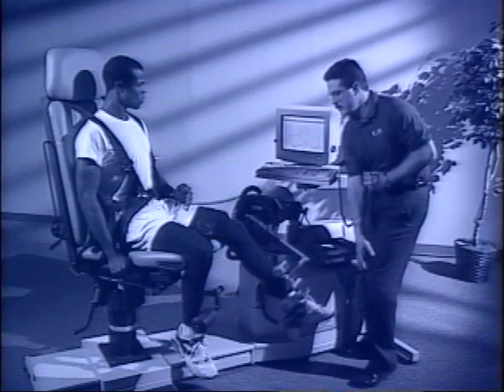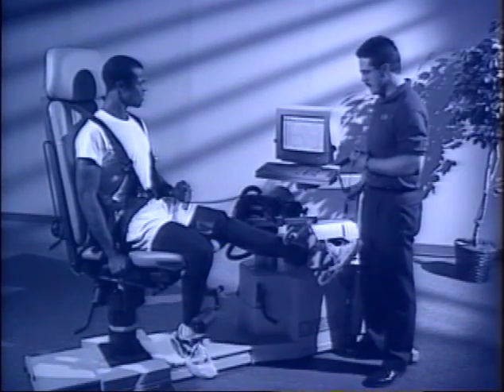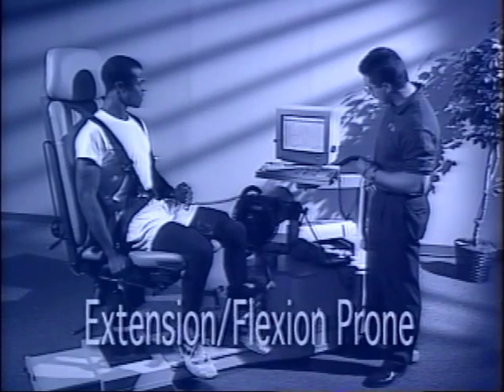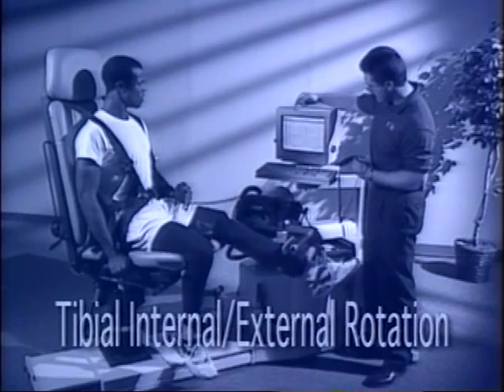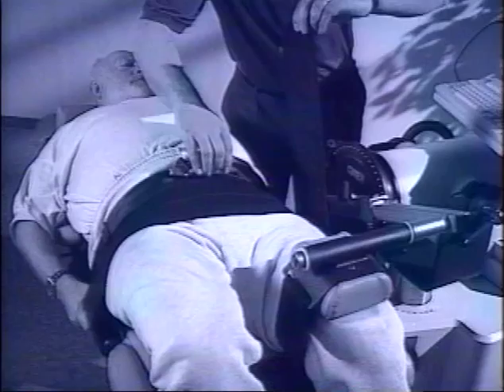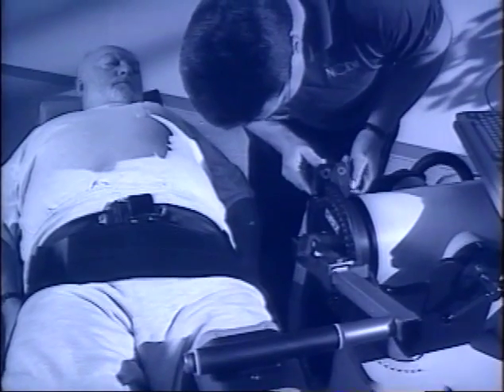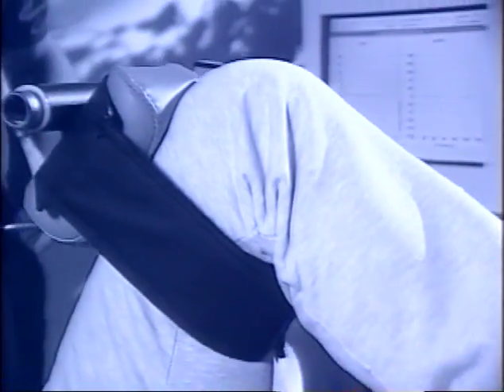How many knee patterns are there? There are 3 knee patterns: extension flexion seated, extension flexion prone, tibial internal external rotation. The majority of my patients are geriatric, and many of them require total joint replacement therapy. How does NORM handle those setup patterns? NORM is excellent for all joint replacement therapy. Geriatric patients are especially comfortable on the NORM system, and the on-screen graphics help to motivate them.